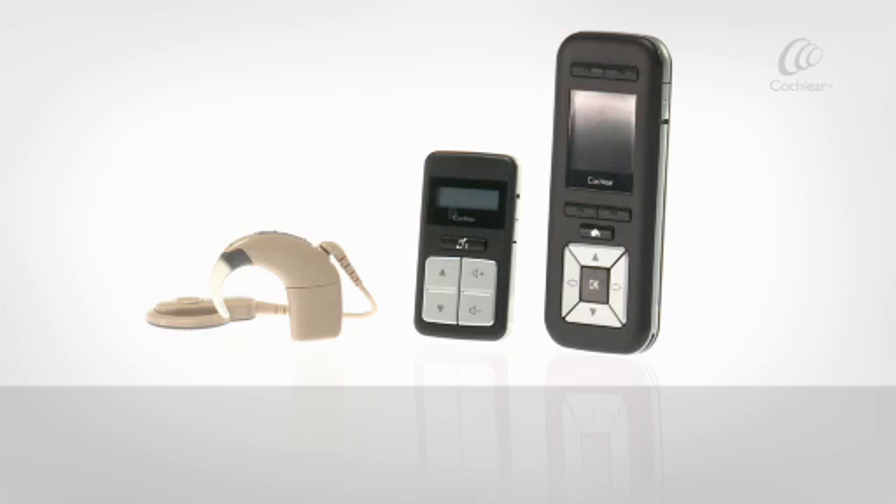Whether you choose auto or manual telecoil, you can control the telecoil with your remote. You can also turn manual telecoil on and off with your processor.